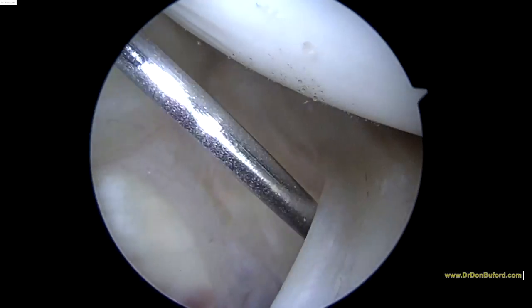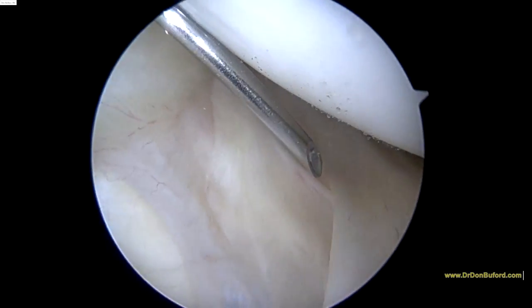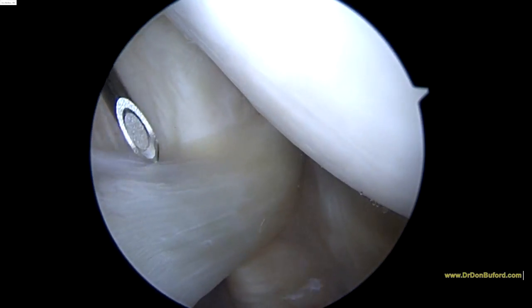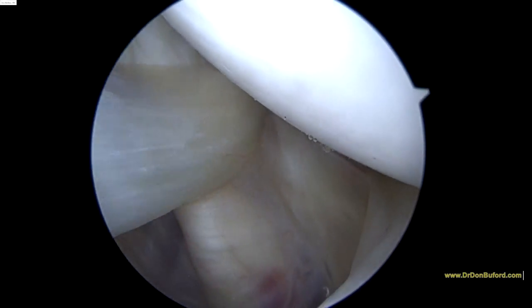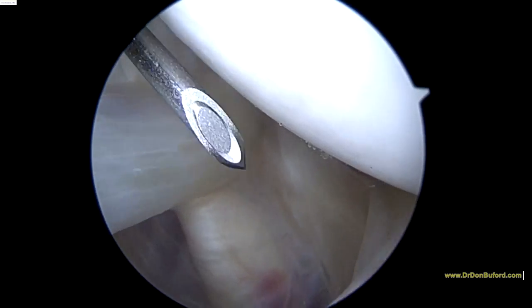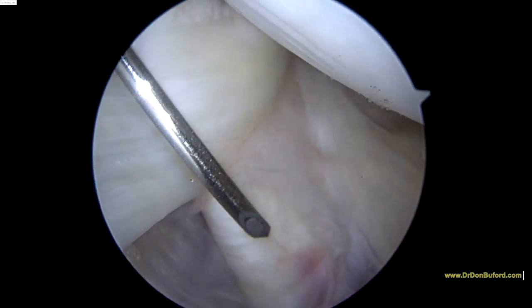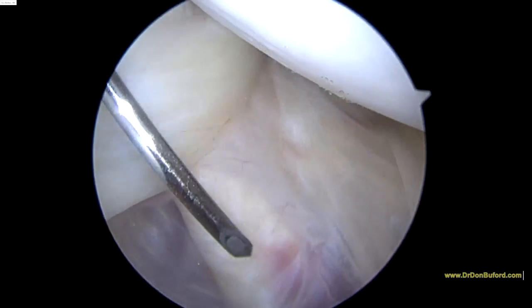There it is right there. So it's a little bit more robust structure, a little bit more of a capsular thickening than the MGL — which again, here's the MGL right here. Here's the inferior glenohumeral ligament. And then running up to the left, down here below, is the subscapularis tendon.